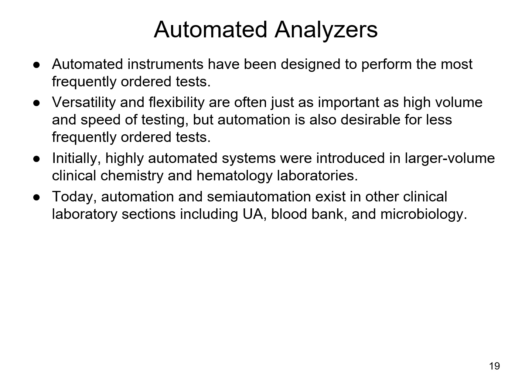Over the years, we've seen more automation come out into the laboratory. So there are a lot of tests out there that up until a few years ago were still performed manually, and then automation has been developed. So some of these tests are transitioning away from manual testing to more automated platforms. And this allows for versatility and flexibility. It allows you to take a higher volume of those test orders in, which speeds up the whole testing process, which ultimately in the end is better for the patient because you can get results out a little bit quicker.